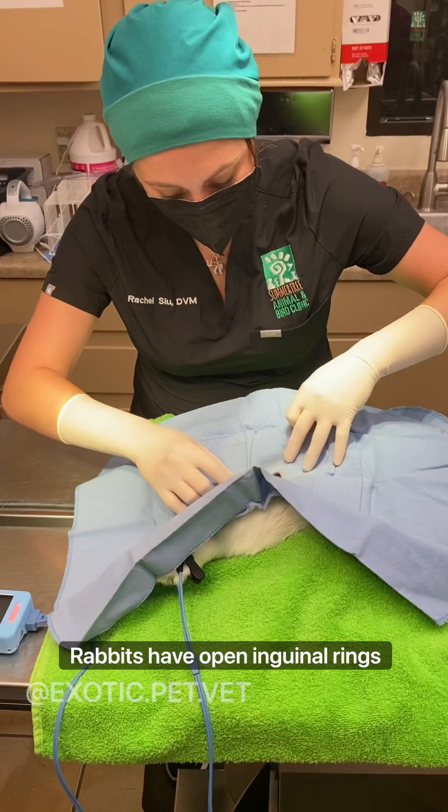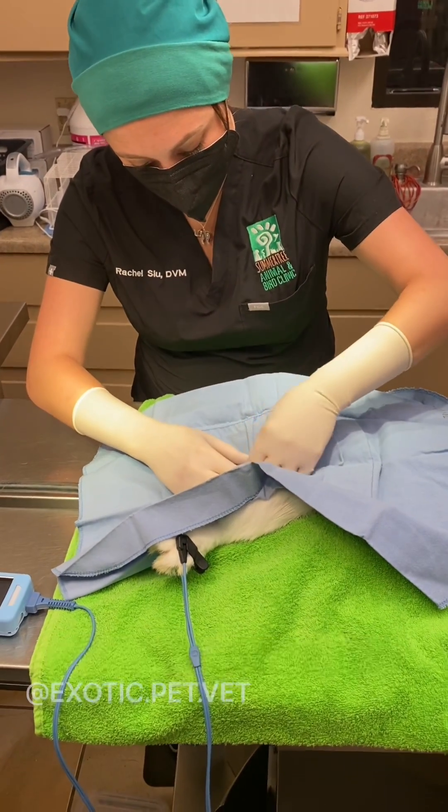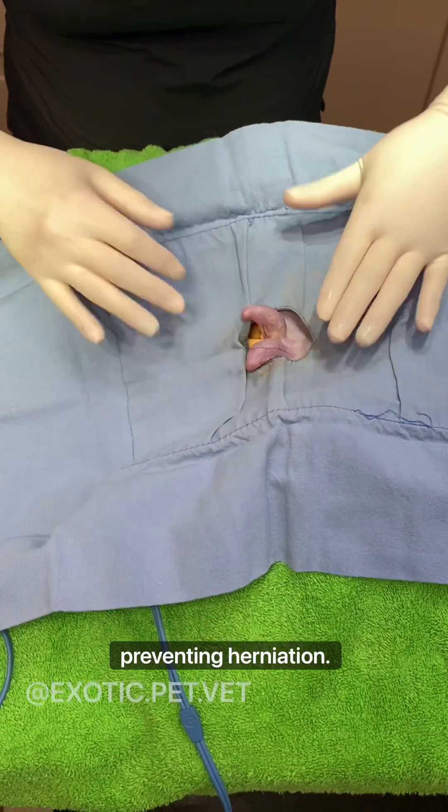Rabbits have open inguinal rings that allow the testicles to be withdrawn within the abdomen. With the closed method of castration the vaginal tunic remains closed, preventing herniation.